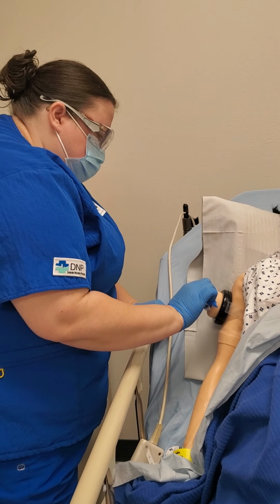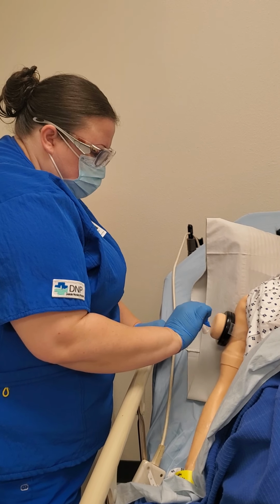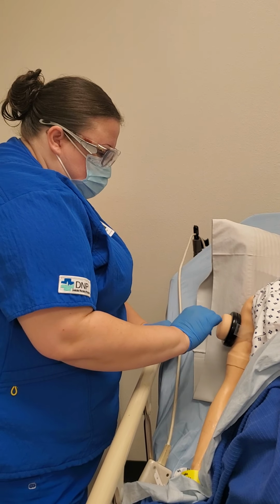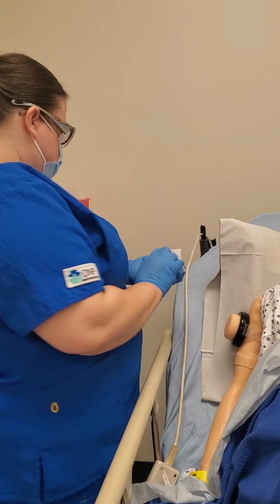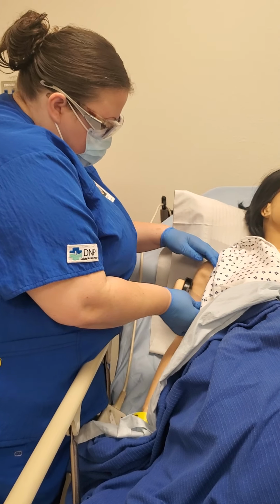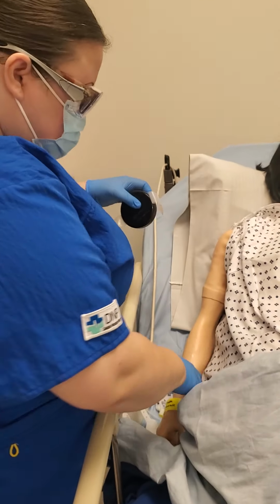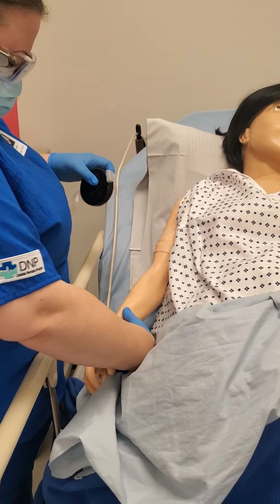I'm not gonna rub the area because of the Z-track method, but I'm just gonna put a little bit of pressure to make sure the solution stays in. Okay. And then I'm gonna move my thing here down to the bottom so that I can do her TB test.